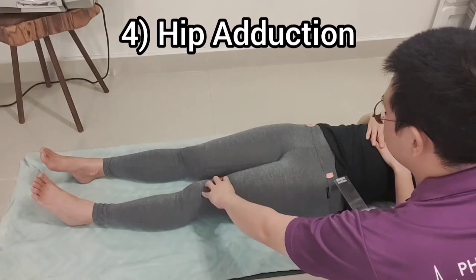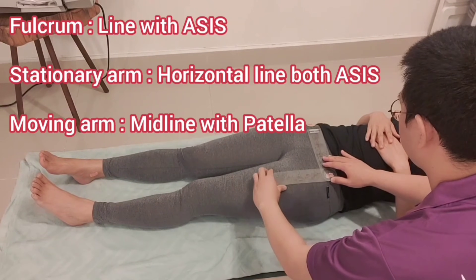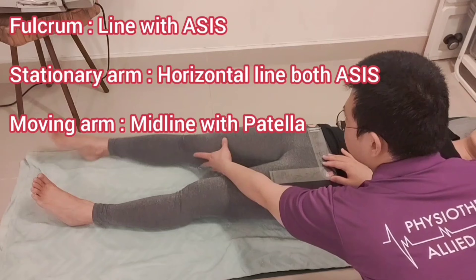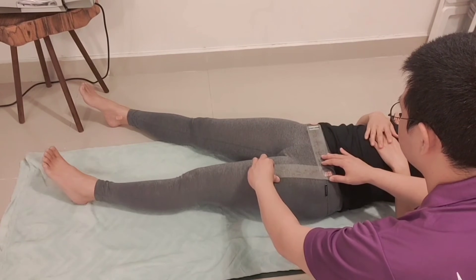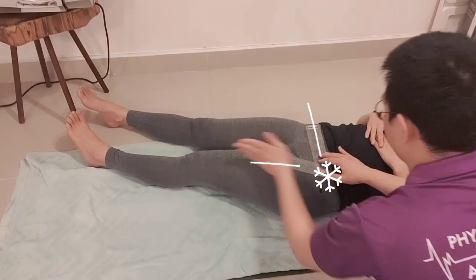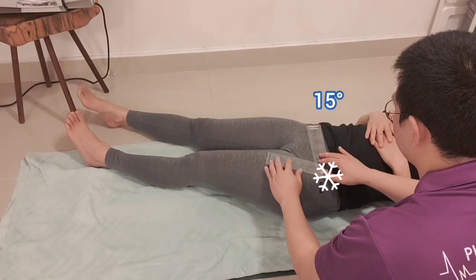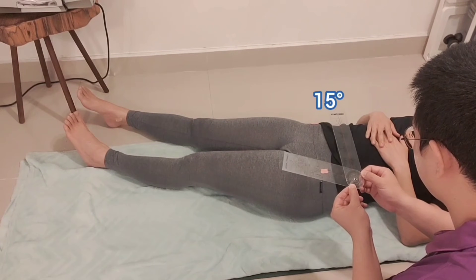Range of motion of hip adduction. The fulcrum is the same as for hip abduction. One difference is to move the right leg slightly away to avoid interference during the left leg range of motion. The stationary arm and moving arm are also the same as hip abduction. The foot and kneecap should face the ceiling.